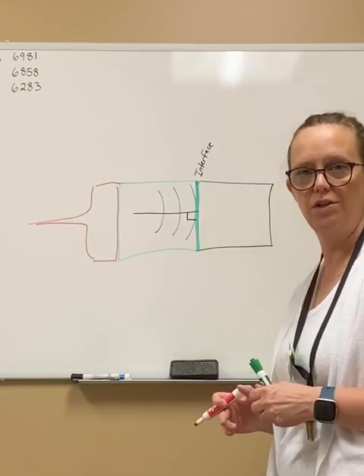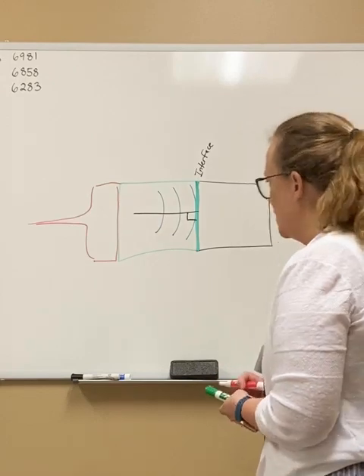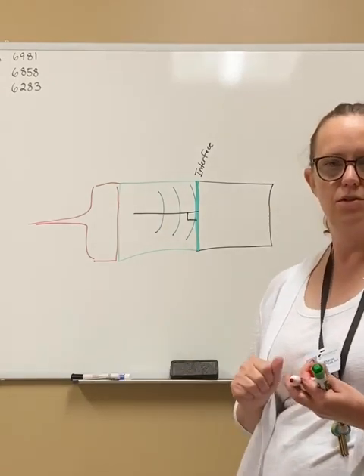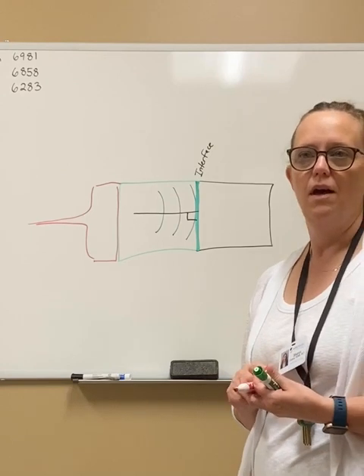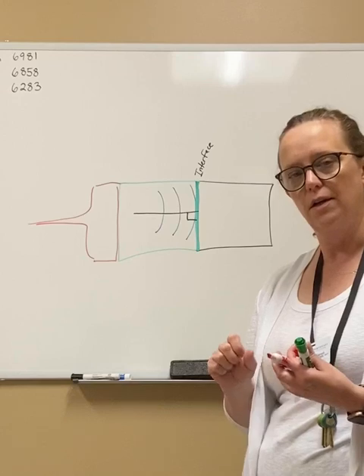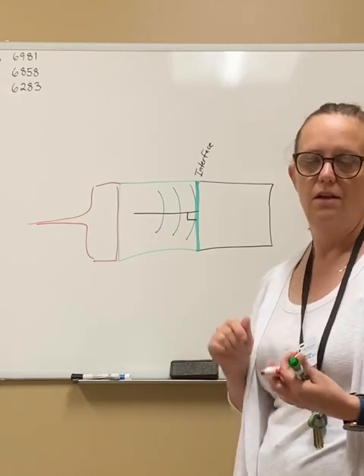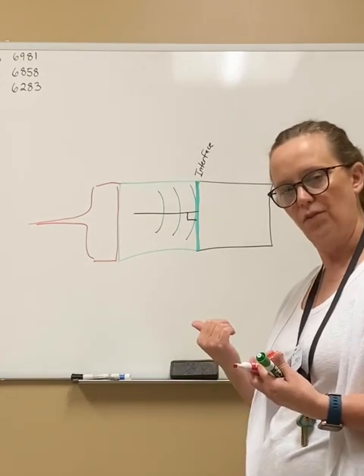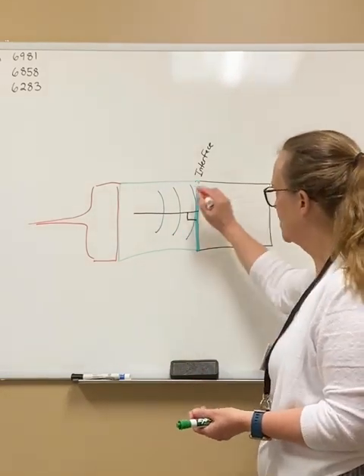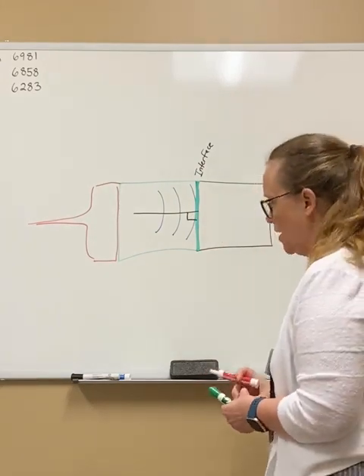Just a little demonstration about the angles of incidence terminology. When the transducer sends a wave into the body, the wave is propagating through tissue, and it strikes a surface or a tissue interface. That wave that's coming through the medium is called the incident wave. So here, in blue, is the depiction of the incident wave.